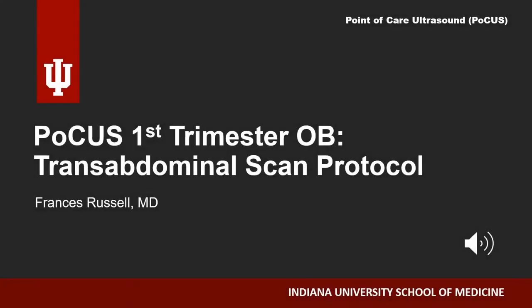This is Frances Russell, and in this module, we will review early pregnancy transabdominal ultrasound scanning technique.